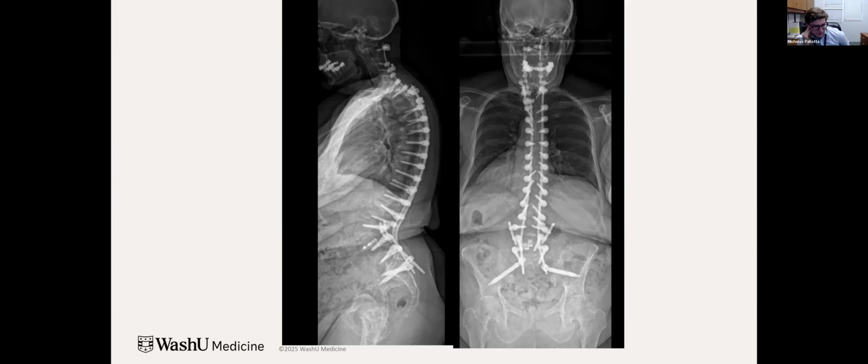Yeah, so the posted system, I use essentially two modes. They can be monos, essentially true posts, or alternatively, they can turn into sort of a polyaxial screw.